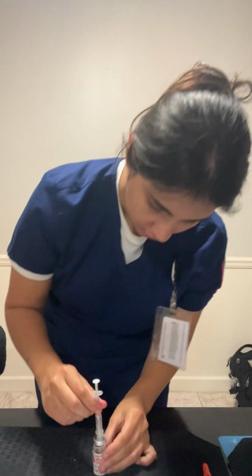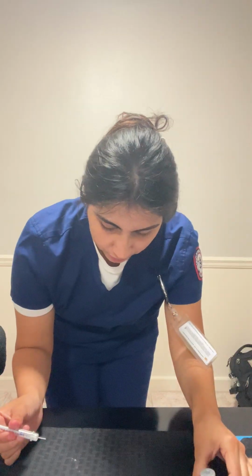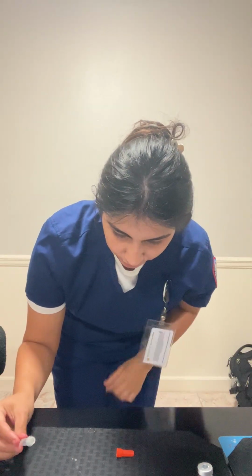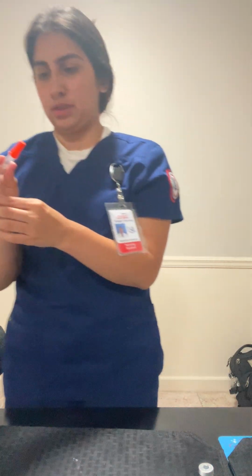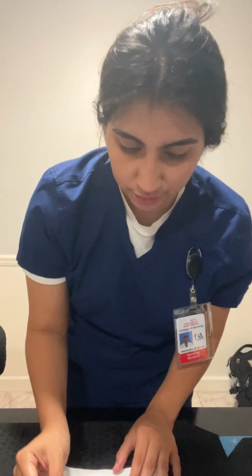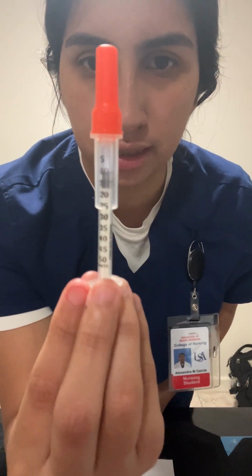Hopefully you can see. Then take out the syringe, and I'm going to scoop the cap so I can recap. I'm going to compare with my MAR the right dose, which is 10 units, and show it to the camera. 10 units.